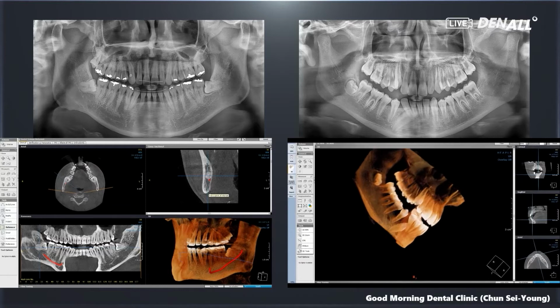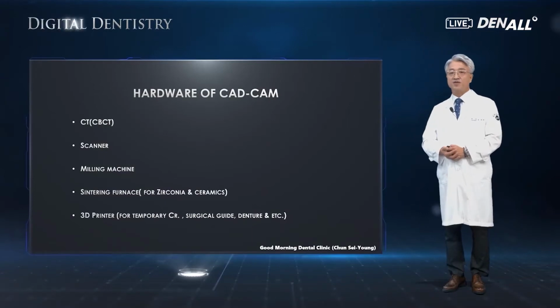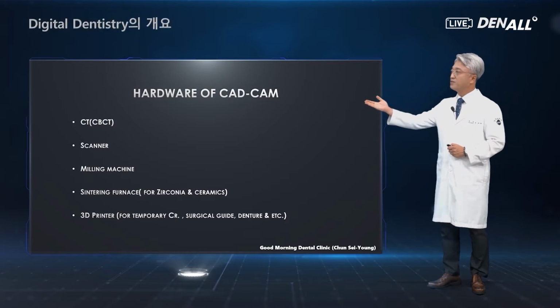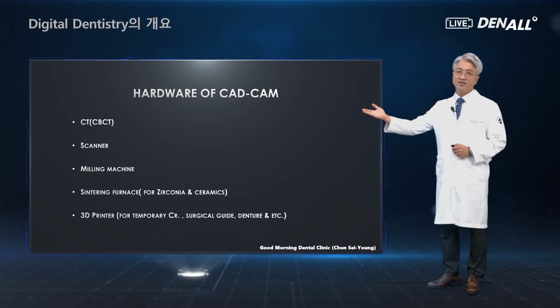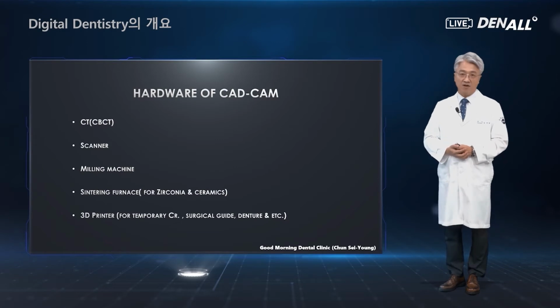These processes can be attributed to the advancement of digital technology. I believe you agree with me. Let's talk about the hardware story, like CAD-CAM. CBCT, the CT machine, is widely used in dentistry, and a lot of people are taking interest in the scanner.